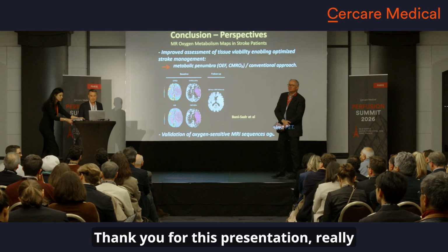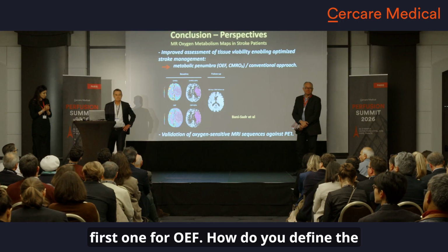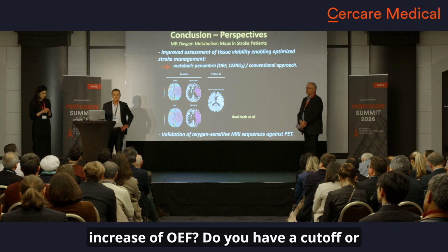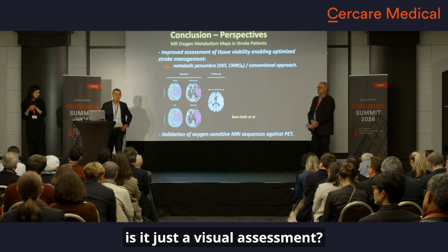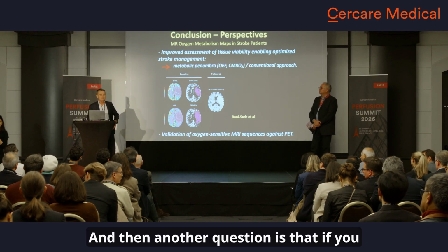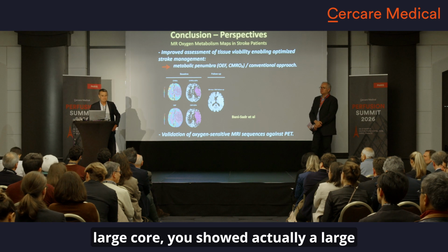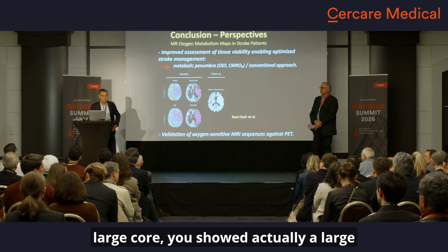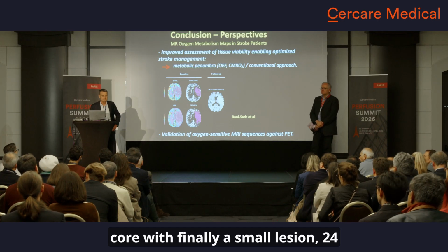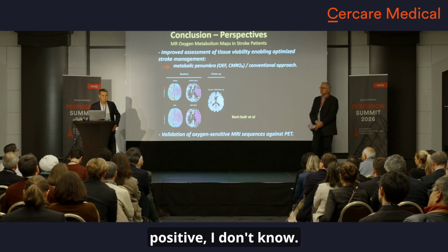Thank you for this presentation, really interesting. I had two questions. The first one is for OEF. How do you define the increase of OEF? Do you have a cutoff or is it just visual assessment? And then another question is whether you have some clinical data, especially in large core. You showed actually a large core with finally a small lesion at 24 hours. So maybe that's why trials were positive, I don't know.